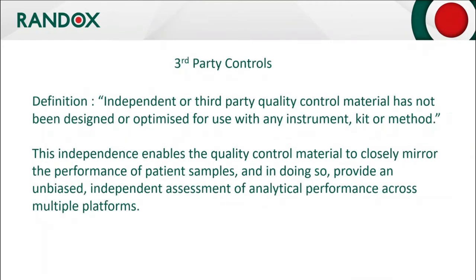Third-party controls. By definition, independent or third-party quality controls have not been designed or optimized for use with any instrument, kit or method. This independence enables a quality control material to closely mirror the performance of patient samples, and in doing so, provides an unbiased, independent assessment of analytical performance across multiple platforms.